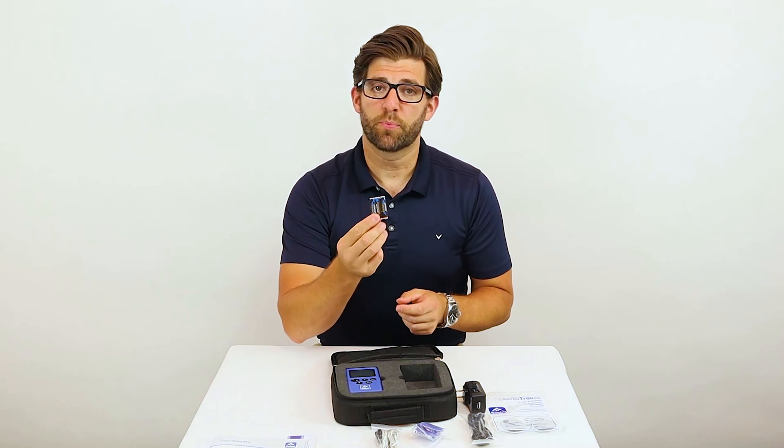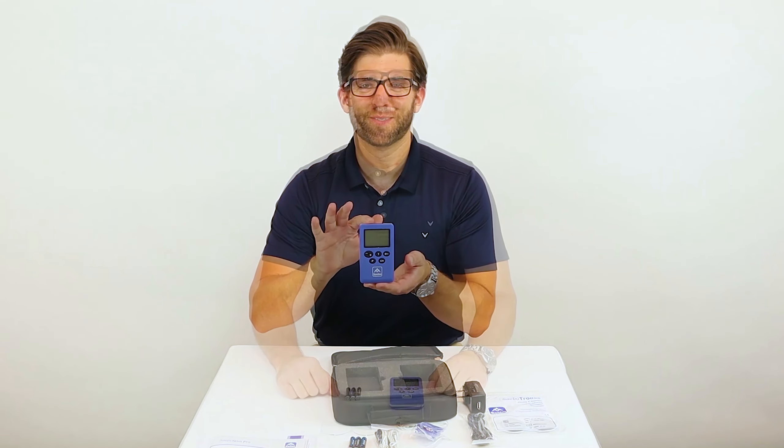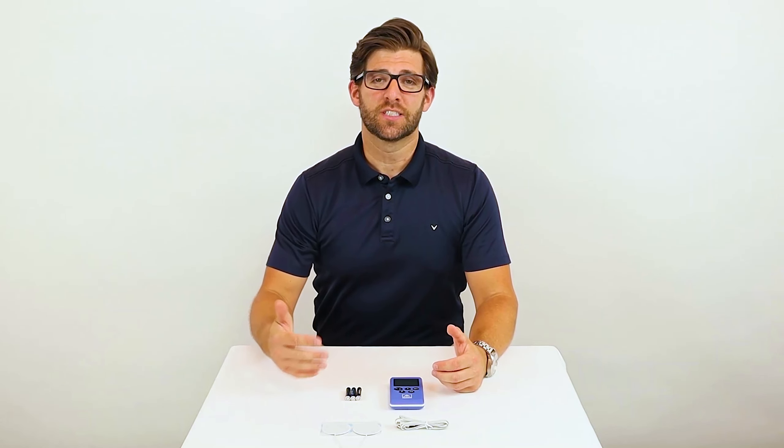You have three AAA batteries. And last but not least, your Sable Stim Pro. One of the first things you're going to want to do when you unpack your Sable Stim Pro is insert the batteries into the Sable Stim Pro.